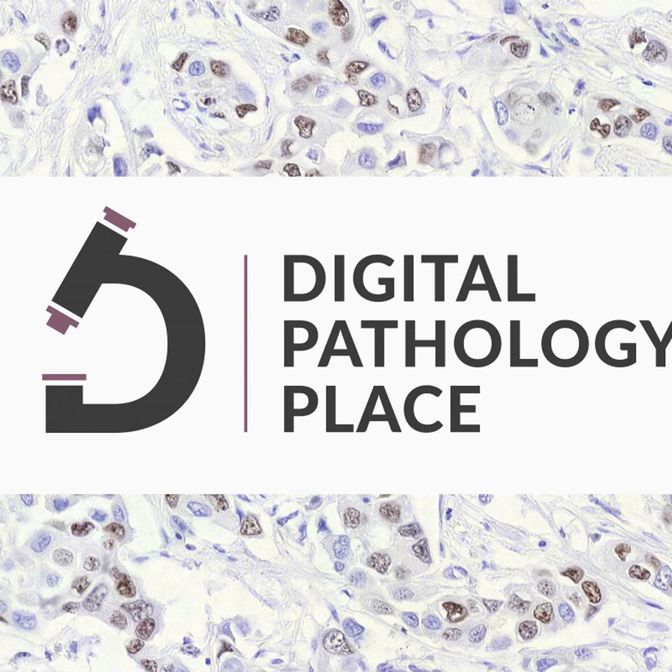And are you anywhere close to finding it, or is it going to be trial and error? That's also why I say these attention mechanisms are not perfect. We are using attention for this, so we know the spatial regions that are important, but what is exactly important within those regions? Maybe the nuclei are on average 5% larger than in the other cases.